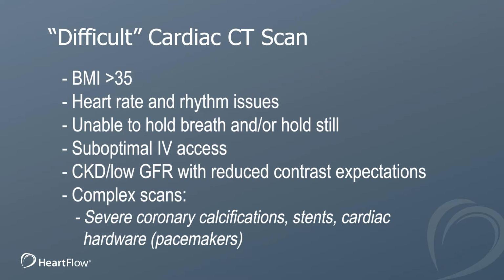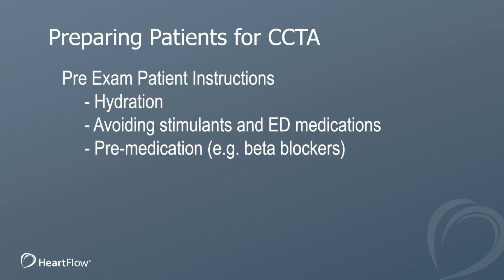We also have complex scans related to inherent patient factors. For example, if they have severe coronary calcifications or stents or pacemakers, this can cause blooming and problems with assessing the lumen. So starting off with patient preparation prior to their coronary CT appointment, we have to give them some pre-exam instructions. And some of that is hydration.